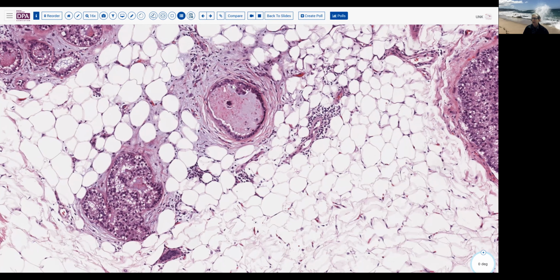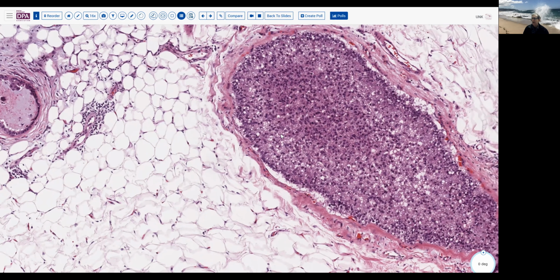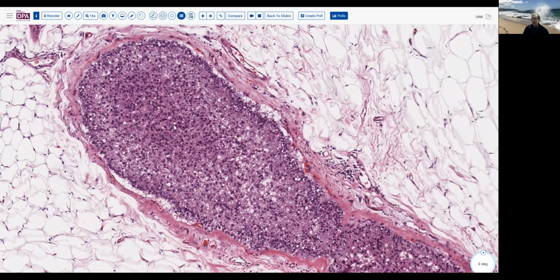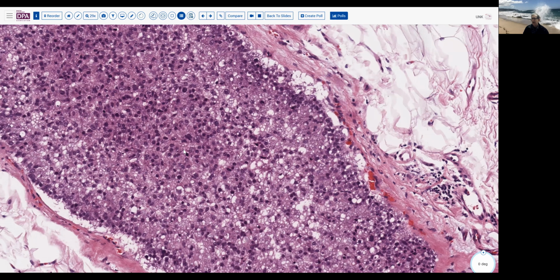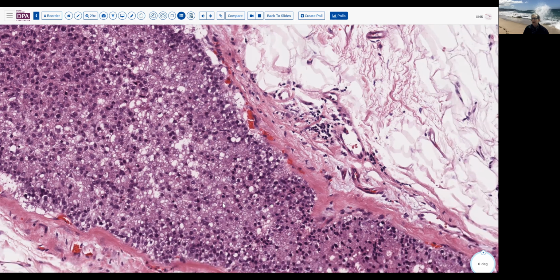And here's sort of the clinging pattern, if you will, of in situ carcinoma. Here an example of a more solid pattern of growth. Now in general, in situ ductal carcinoma tends to be fairly monomorphic in terms of nuclear size and shape, especially in the lower grade lesions, in contrast to usual ductal hyperplasia, which can actually have a fair degree of pleomorphism.